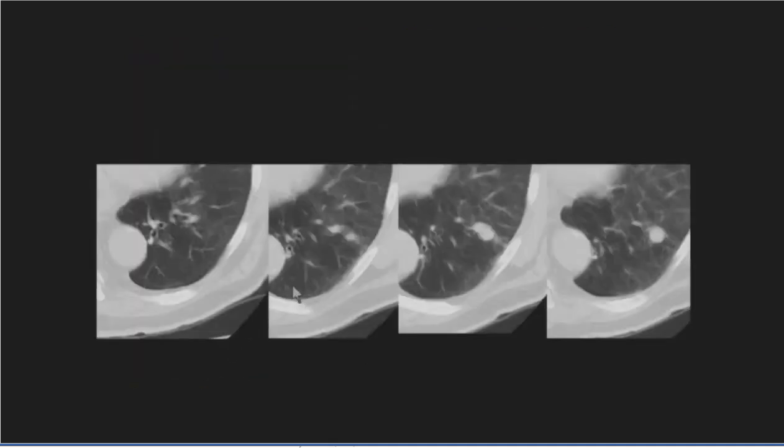Now this nodule is an example of how morphology and shape can help. We can see that there's some respiratory motion, but this nodule is on multiple axial sections. And it almost has this tubular component. And another clue is that the airway is seen right next to it and it's normal in caliber, because oftentimes we can wonder, is this mucoid impaction? And more likely it is that. But when we see a normal small airway next to it, that means the airway is preserved and normal.